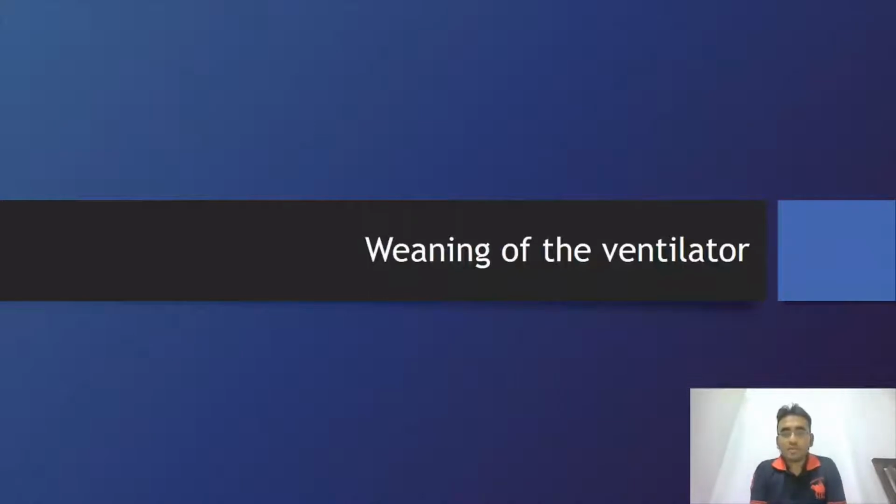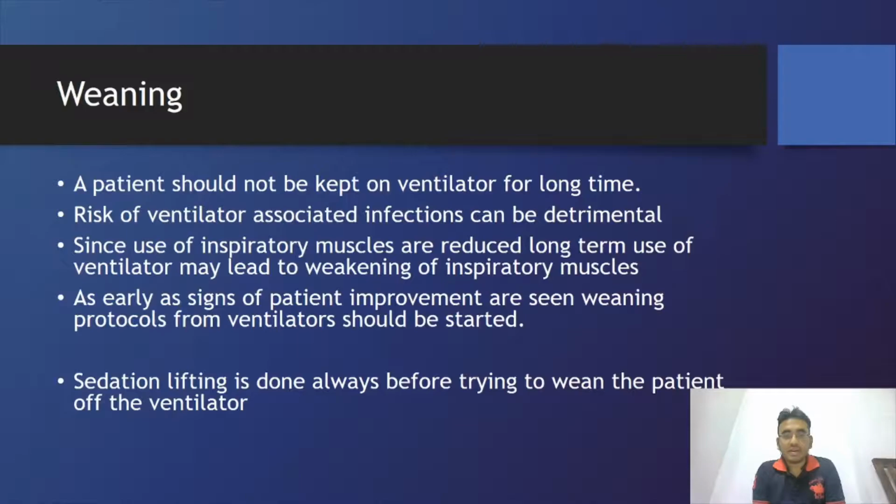So, weaning or liberation from the ventilator. As you all know, you cannot keep a patient on a ventilator for a very long time, for obvious reasons. One is that whenever you keep a patient on a ventilator for longer, there is always a risk of infection, and ventilator-associated infections are very difficult.